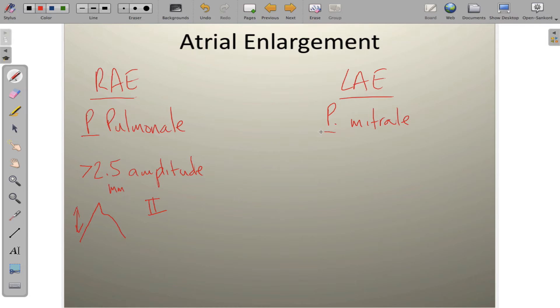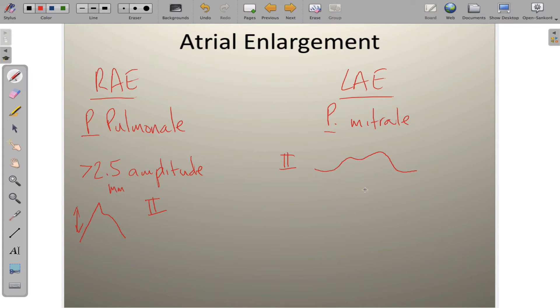In left atrial enlargement, in lead 2, what you get is a P-wave that looks like an M-shape — it has two distinct peaks. The right-sided peak tends to be taller than the left-sided peak. The P-wave also gets wider — we're looking at a duration of 110 milliseconds or more. These are the changes associated with lead 2.